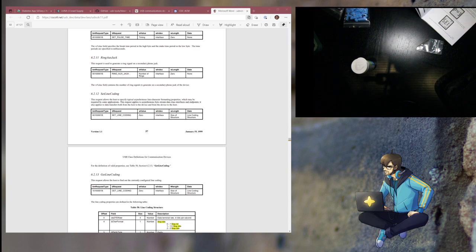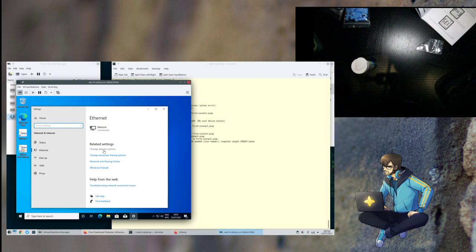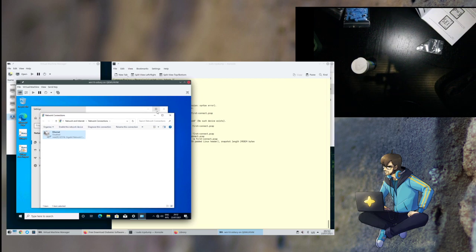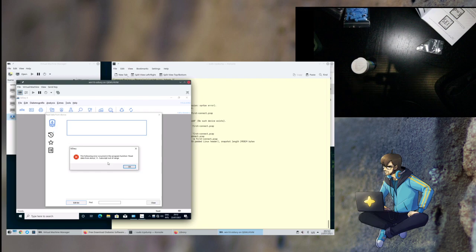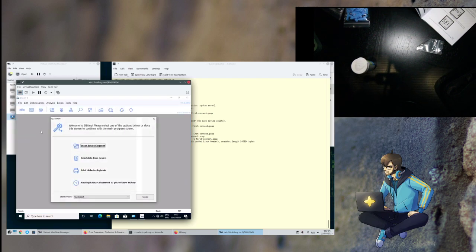Completed the request changes. Okay, now I can go back to show you the VM. Now I can disable this. There you go. I'm reopening Side Diary, and I want to read data from device. Read data from device: subscript out of range, and everything dies. Not the most reliable.